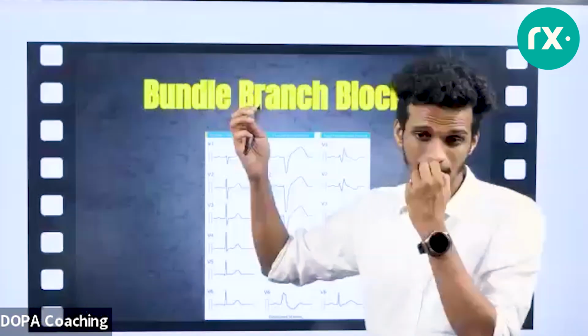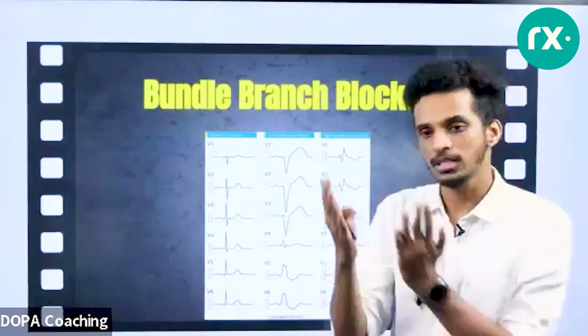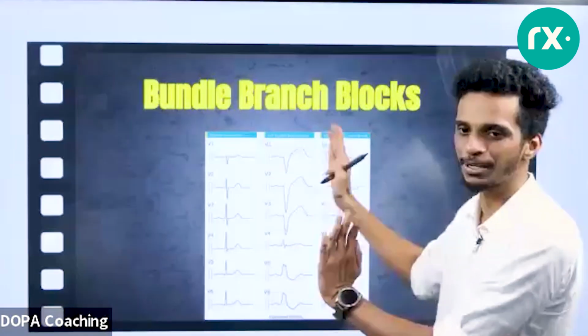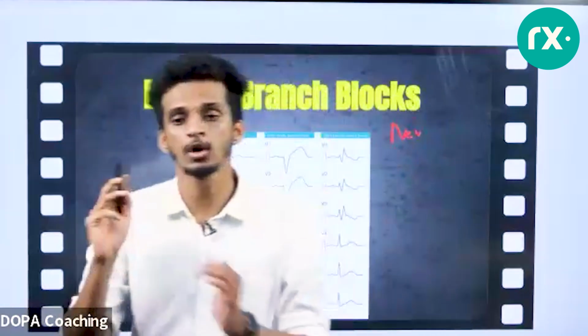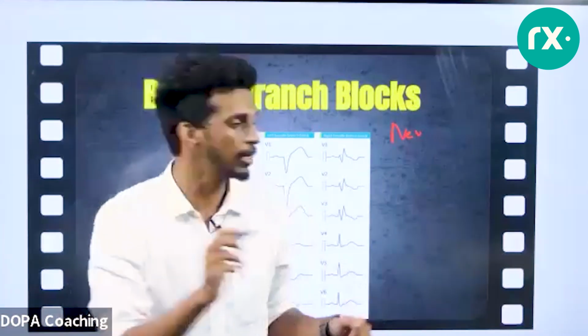Bundle branch blocks actually is extremely important because left bundle branch block is actually equal to STEMI. So that's why I'll just tell you about left bundle branch block alone. Let right bundle branch block be there, because of new onset LBBB. There are certain things called STEMI equivalents, because all STEMIs do not present as ST deviations. And most important STEMI equivalent is an LBBB.